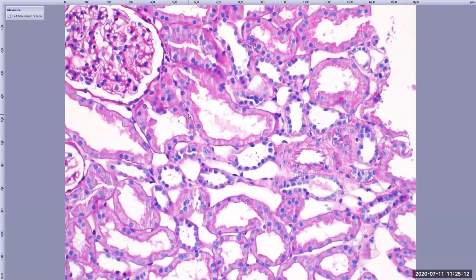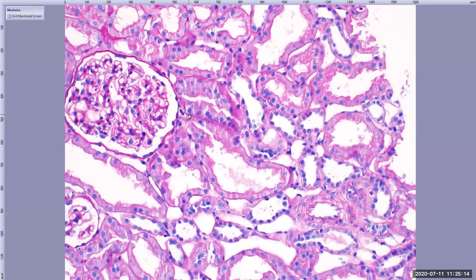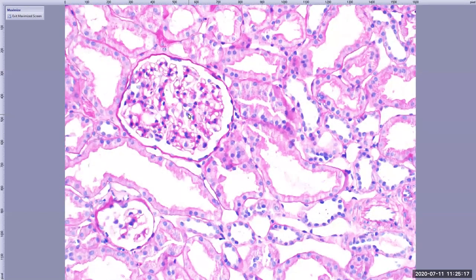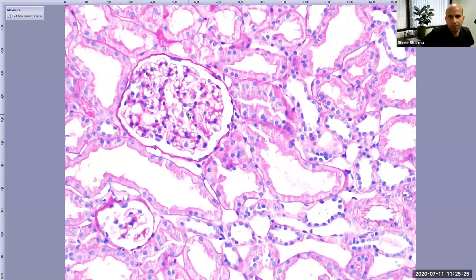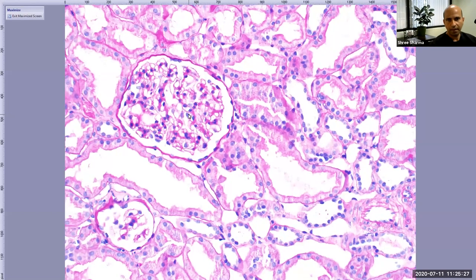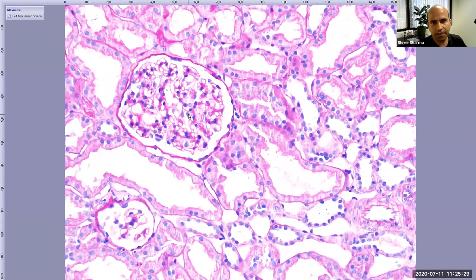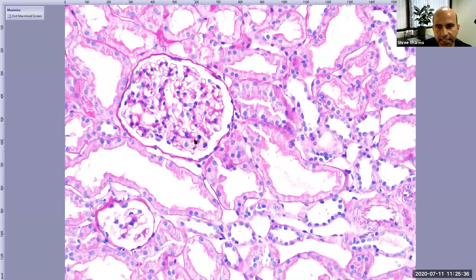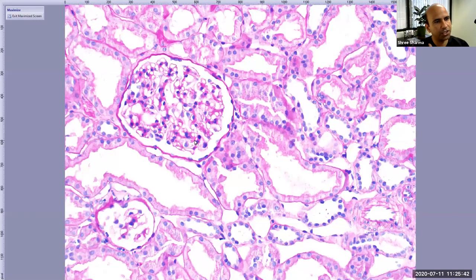That was great. Just to go back to basics — how do you tell the difference between H&E and PAS stain and know which one you are looking at? I can say this is a PAS stain because this pink is much more vivid and brighter than the H&E stain I showed earlier. I went over glomerular morphology on the H&E stain; this is a PAS stain.